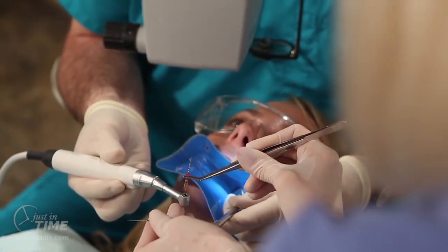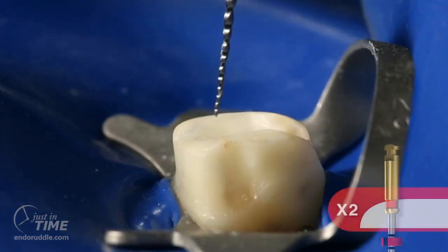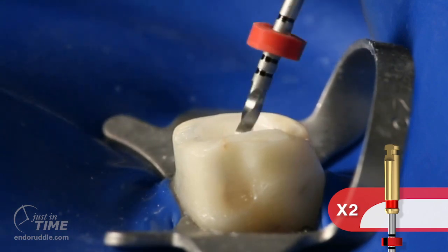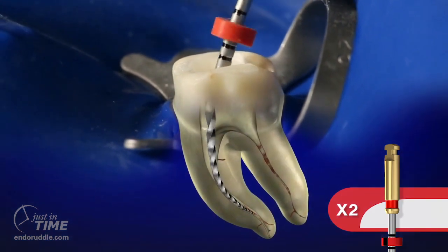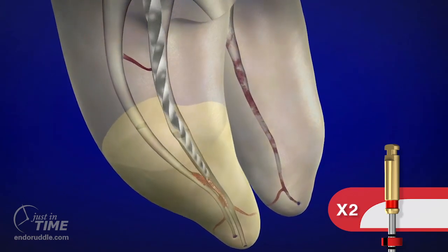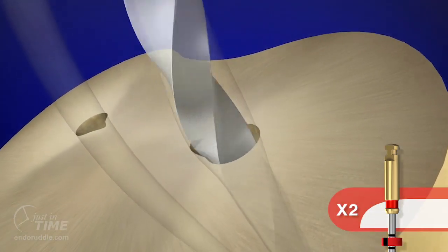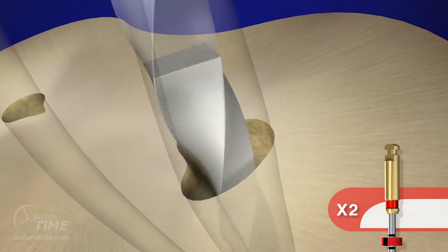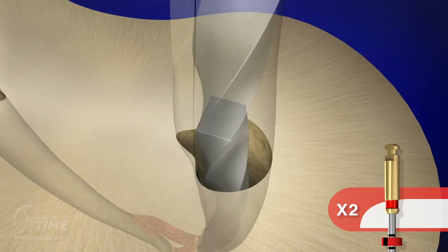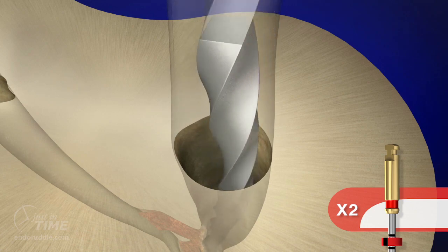We can now continue using the ProTaper Next X2 file. Train your chair-side assistant to benefit the economy of time. From the lateral view, you can really see I'm emphasizing brushing. Brushing gives us more centered preparations. Brushing maximizes remaining dentin on the furcation side, and it ensures that we're making more contact than just using a pecking or pumping motion. Recall we mentioned earlier why ProTaper Next performs the way it does. Notice in this cross-section how using a brushing motion serves to improve the contact between the file and dentin. Together, increasing percentage tapers over the active portion of the file, in conjunction with its asymmetrical rotary motion, allows this instrument to selectively cut dentin in a precise region of the canal. Brushing makes working width, which allows the bigger blades to passively move into the canal.